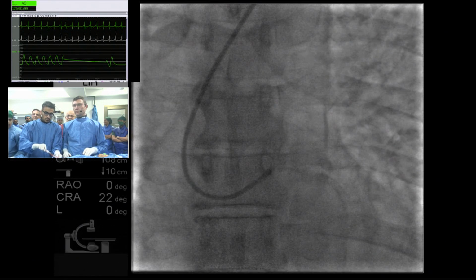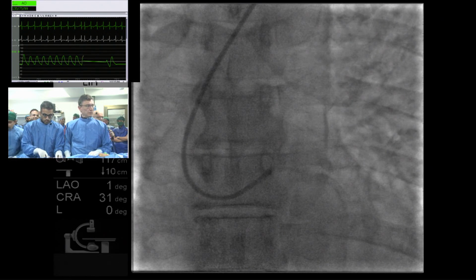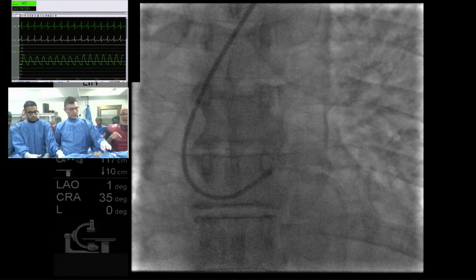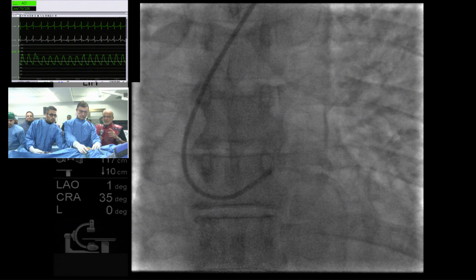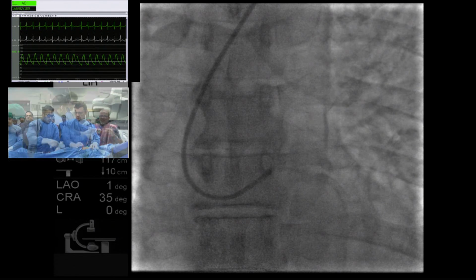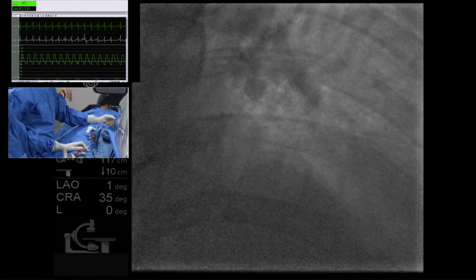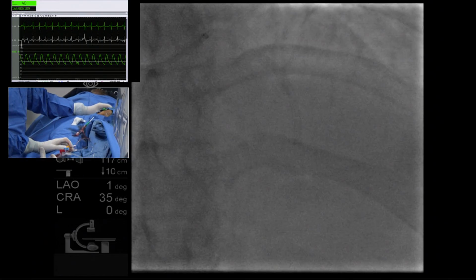This distal dorsal radial puncture has been done. You can show that over here. Yes, and it is done deliberately because we are going through left radial, and supine pronation is a natural instinct, and the patient's hand is pronated and kept very near. So the operator does not have to bend the back.